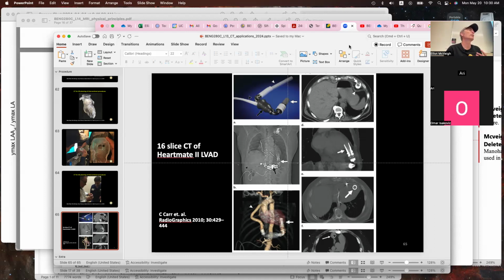And people who come in with chest pain to the hospital, in my book, it's my mom or my dad or something like that, and they've got this chest pain. First thing you do is a CT, and you see, is this actually from coronary disease, right? And in 50% of people, it is not, and their vessels are open and everything, and you just go a different pathway. You don't have to work them up and then go to the cath lab. So that's the main application.